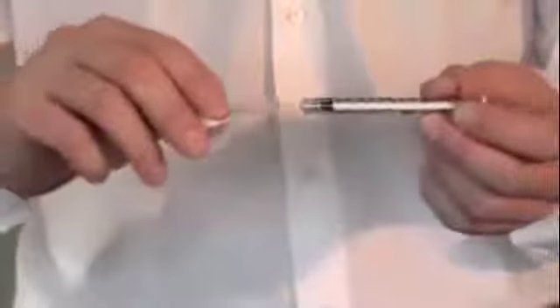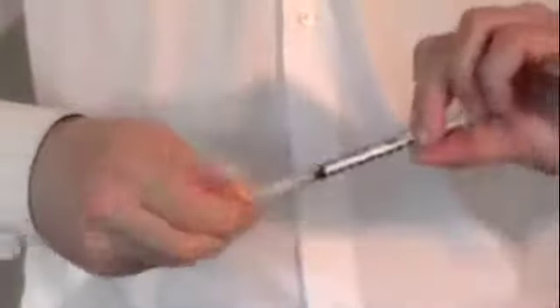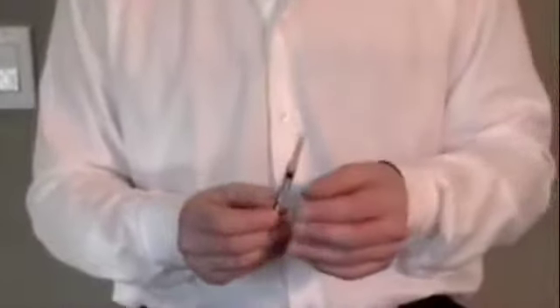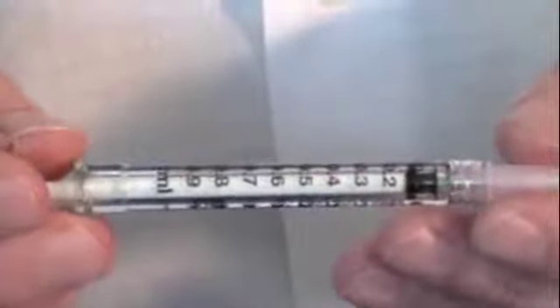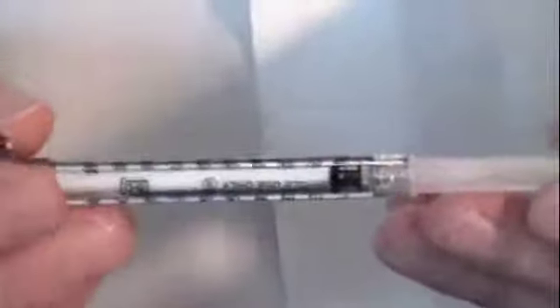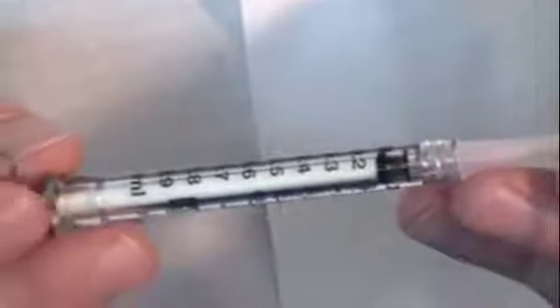At this point, you can remove the 1 cc lock syringe from its packaging. You're going to want to twist the 18 gauge needle onto the syringe. At this point, the cap of the needle will keep it sterile. I'd like to show you the 1 cc syringe in close-up. This is marked in 0.1 cc or ml gradients. Keep in mind an ml is the same as a cc. Your dosage may be listed in mLs or cc's.